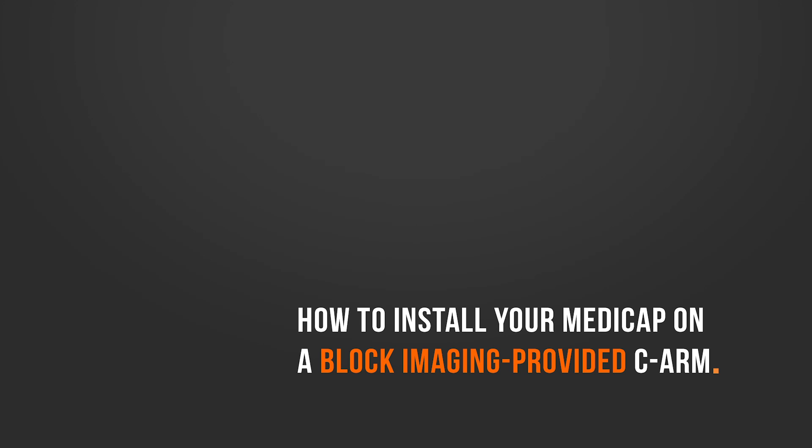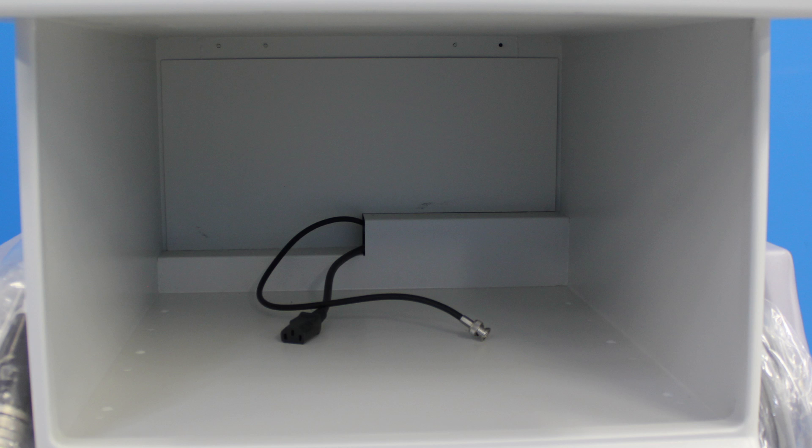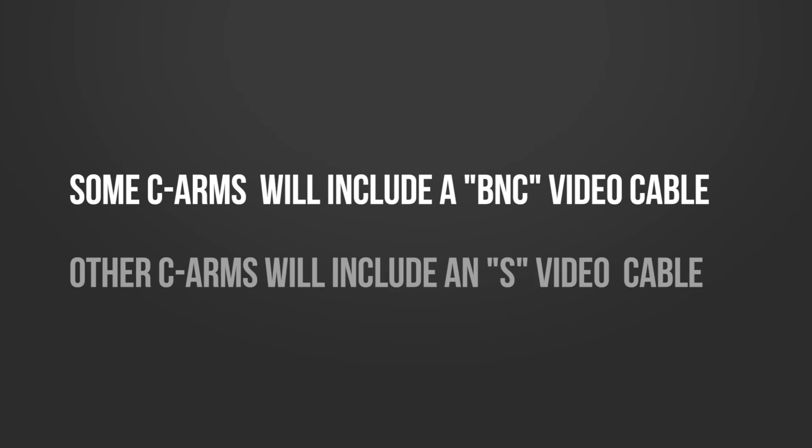If your C-Arm was purchased from Block Imaging, the cables needed to connect your MediCap device will already be run carefully and neatly through the interior of your C-Arm's chassis. In the case of some C-Arms, you'll be provided with a BNC-style video cable. In other cases, it will be an S-video cable.